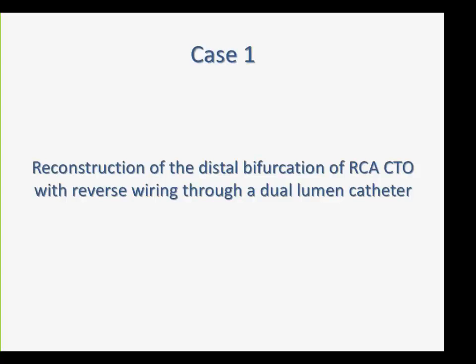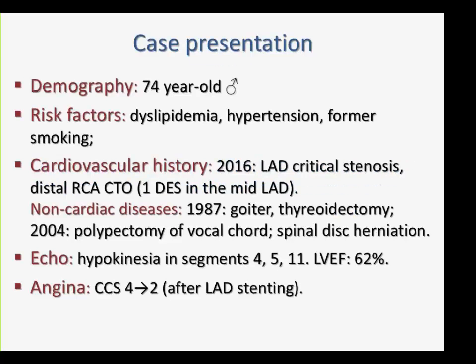So with 3 cases, I would like to demonstrate the problems, the difficulties, and the potential complications caused by side branches at CTO revascularization. Our first case, actually, is not a really challenging case. At least the angiographic assessment of this patient seemed not to be very challenging.